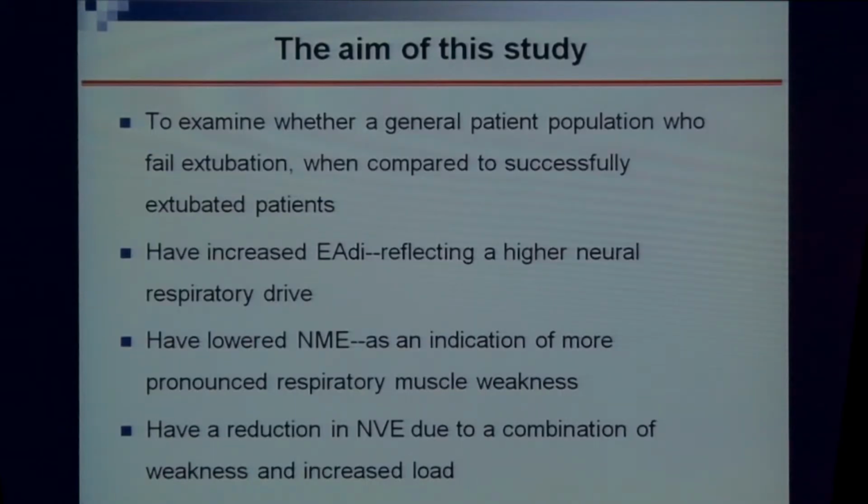So the aim of our study was to examine whether patients who failed extubation, when compared to the successful patients, have increased EDI, reflecting a higher neurorespiratory drive, and may have lower NME as an indication of more pronounced respiratory muscle weakness, and may have a reduction in NVE due to a combination of the weakness and increased load.